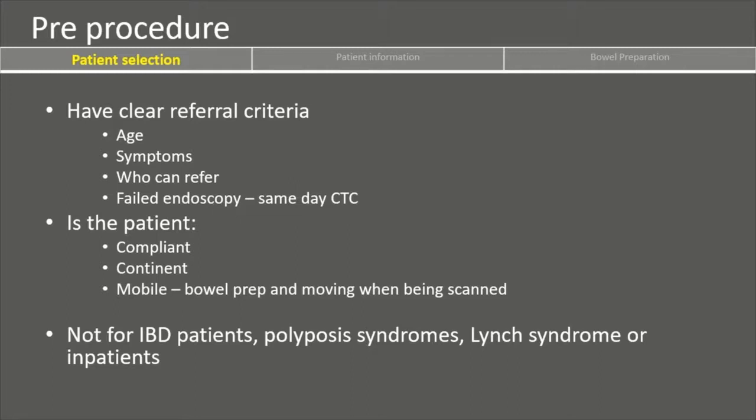And ideally, you shouldn't be performing CTC on patients with inflammatory bowel disease, any polyposis syndromes, Lynch syndrome, and also inpatients. From my experience, inpatient CTC generally results in suboptimal, poor quality studies. So wherever possible, you should be asking that these get referred as outpatients rather than inpatients.